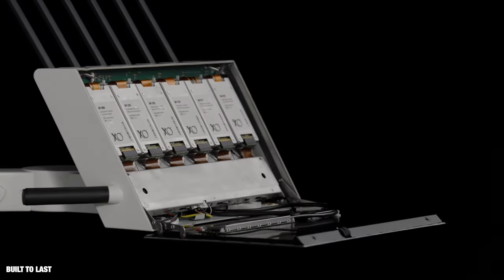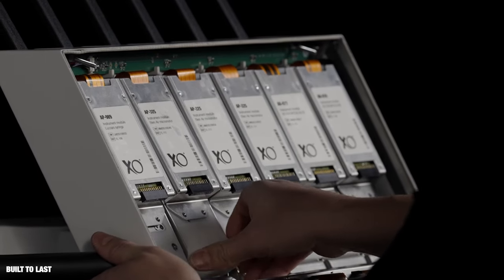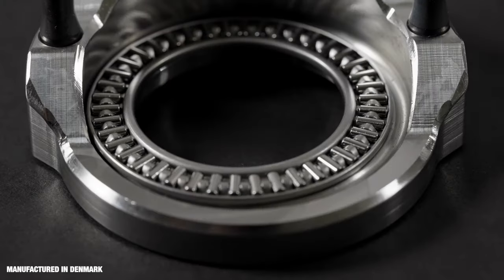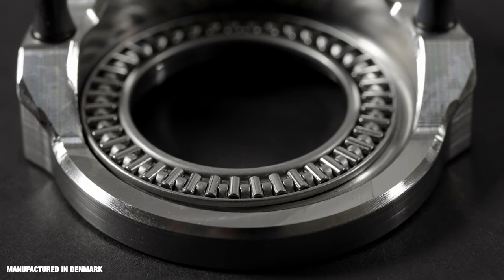ExoFlow is designed to last for 20 years. The digital and modular technique makes it possible to upgrade software and hardware components. The unit is built of cast aluminium, steel, and high-grade materials.